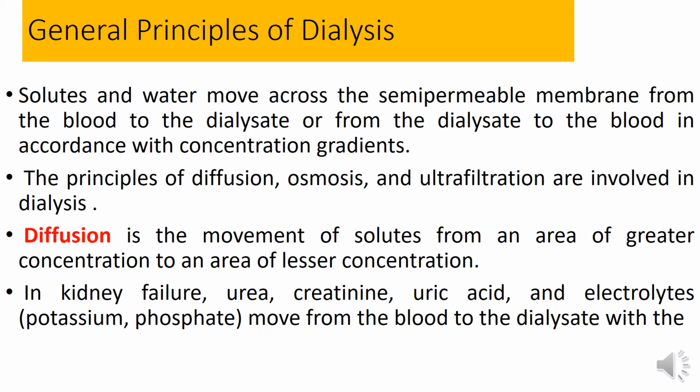Mainly we have three common principles of dialysis: diffusion, osmosis, and ultrafiltration.